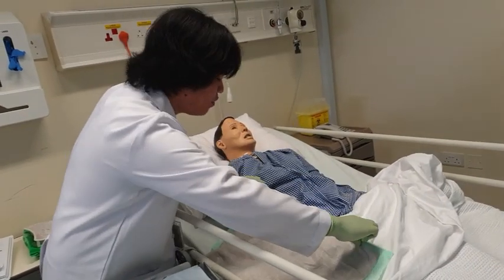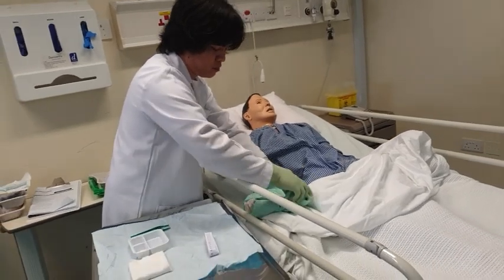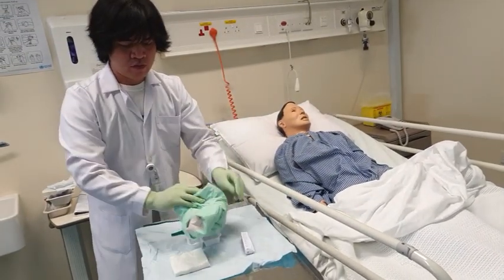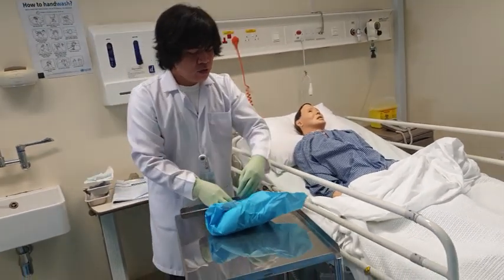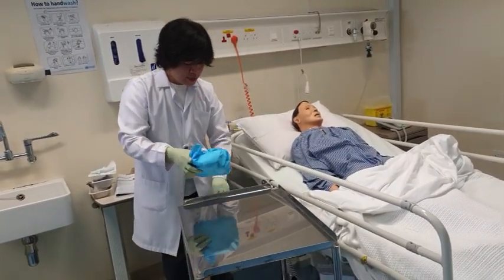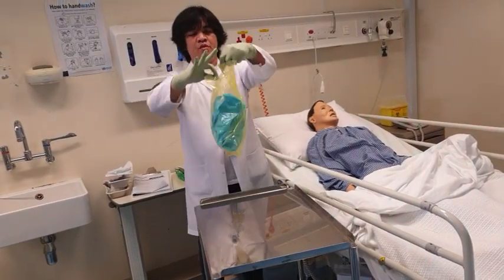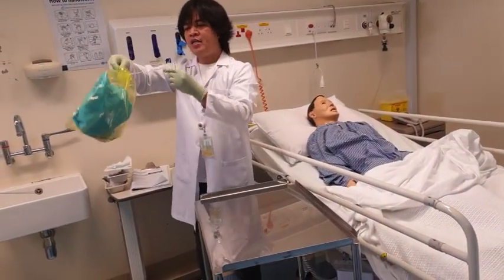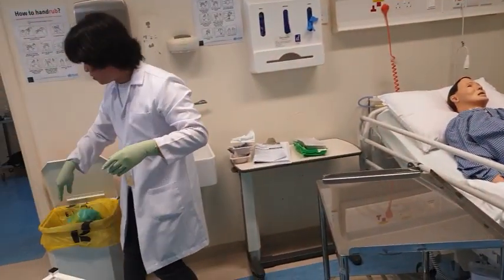Okay, I will remove this one. And make sure to discard used materials properly in here. Okay? Tie it like this and dispose it to the bin.